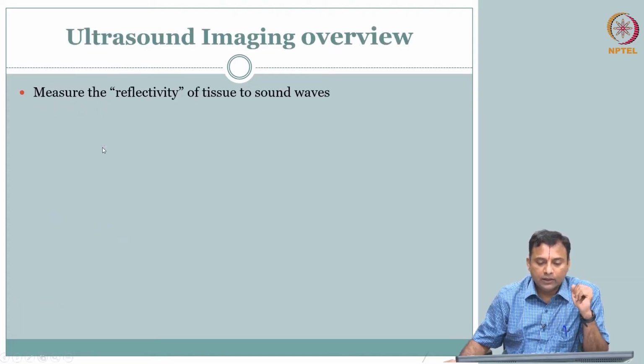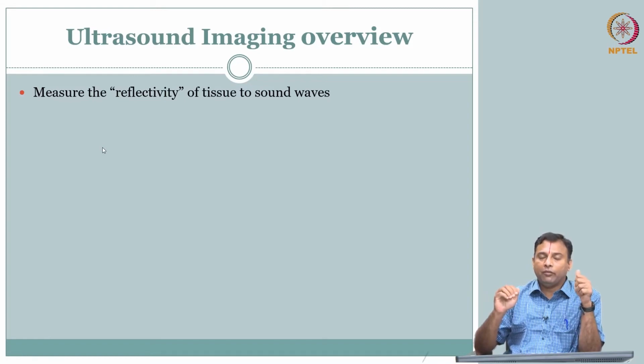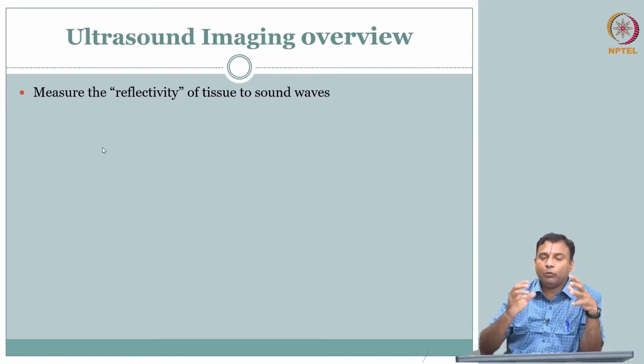Let us start with the overview. What we knew from before, in this course, we have strived to answer this question: for each modality, what is it that we are trying to go after? The image, right, what is the fundamental or physical property of the object that is captured in each of the different modalities?